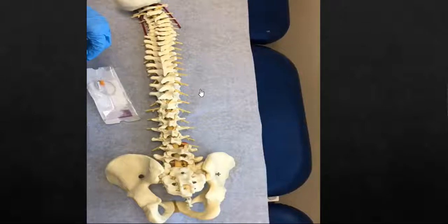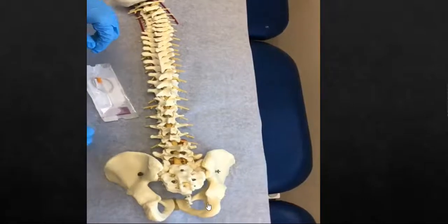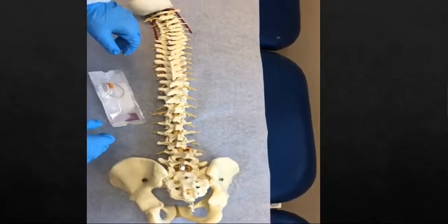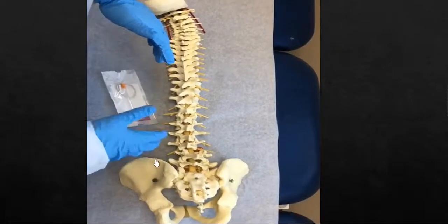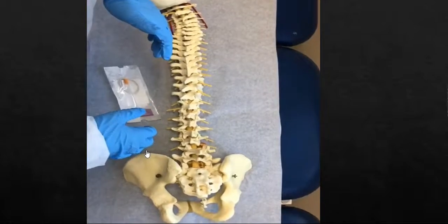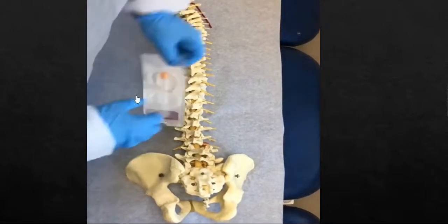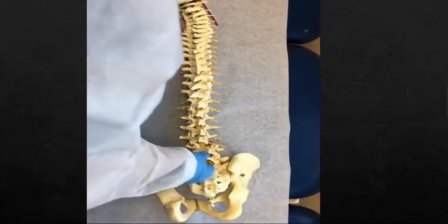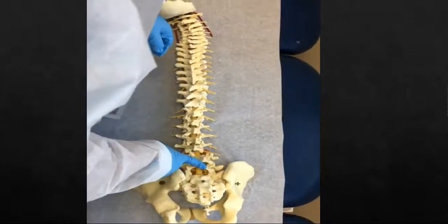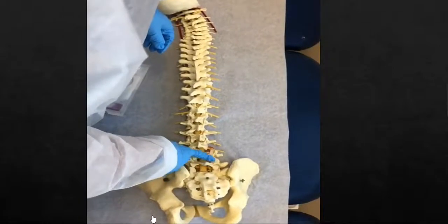I'm going to show you here the procedure of how to do needle electromyographic testing to the paraspinal muscles. First, you're going to use sterile technique, getting your machine ready and your needle. You can choose the needle depending on the depth and how far from the skin the point is that you need to reach the paraspinal muscles.